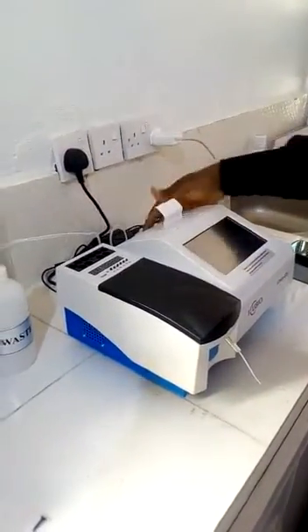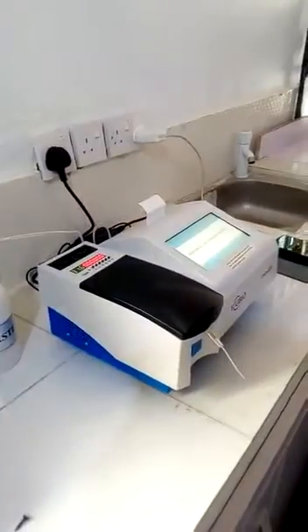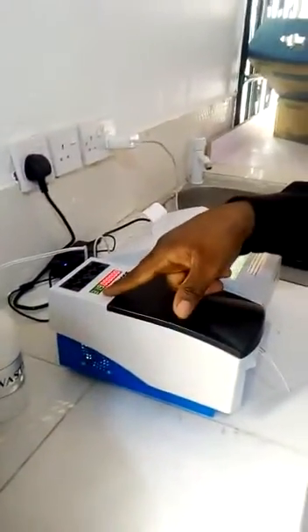So we've plugged it now. The next thing is to power it on. You see the thermos I was telling you about — the temperature will now gradually get up to 37.